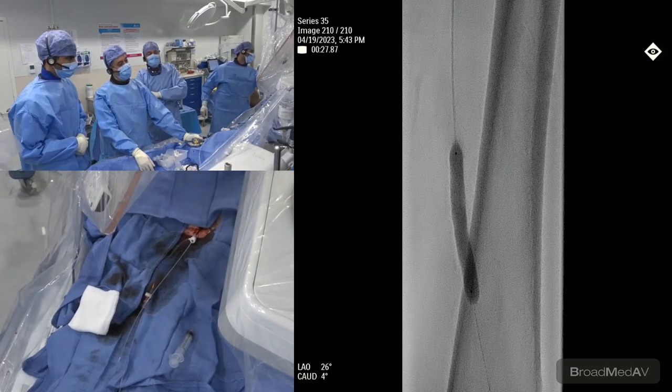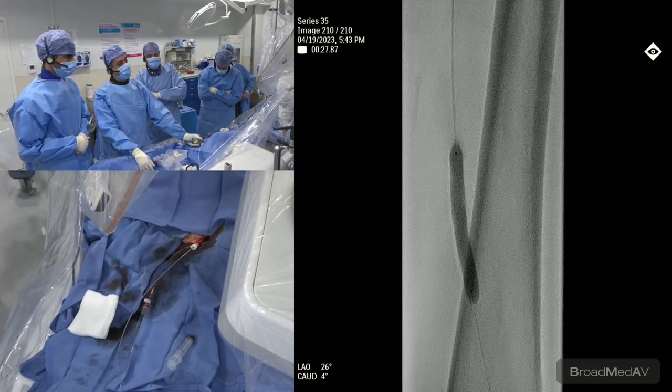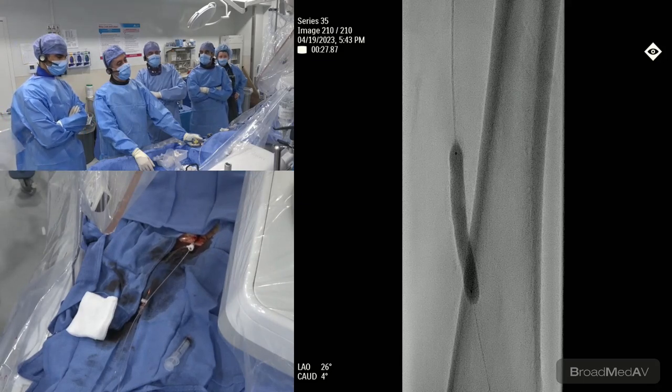You may have a lesion now that you're not happy with. You may look at this, there's a large, ballooned out segment at that area, but that's okay. As long as your gradient is gone and the wound is healed, it doesn't really matter. So yeah, now we're doing this.